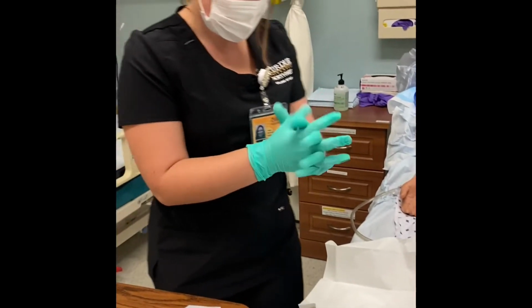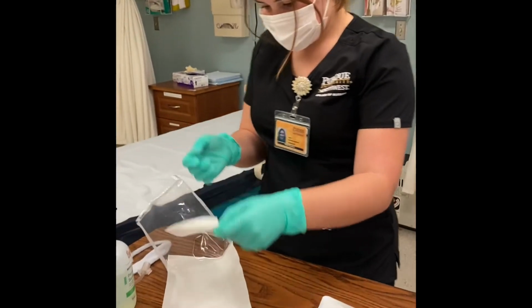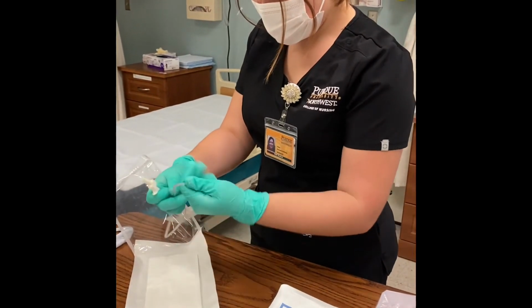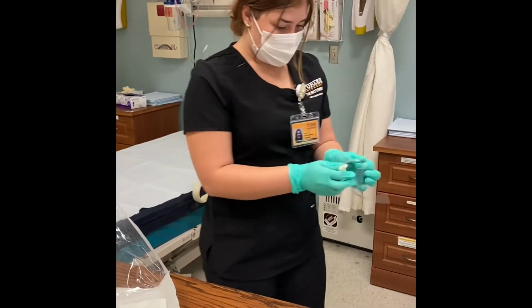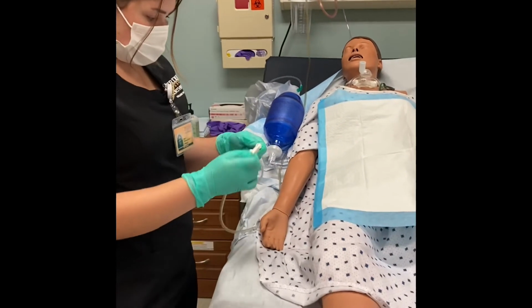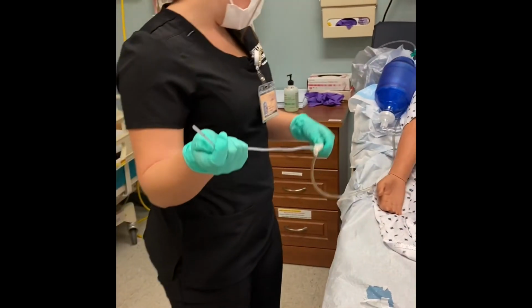Okay, so once those are on, I will discard the packaging. And then the next thing I am going to do is open up the catheter tubing, and I'm going to coil it up in my hand. Okay. Then with my non-dominant hand, I'm going to take the suction tubing and connect it. And then after that, I'm going to test the suctioning with my normal saline.